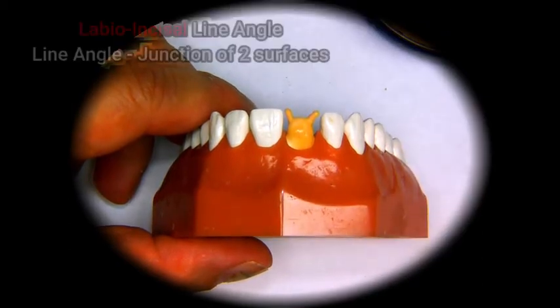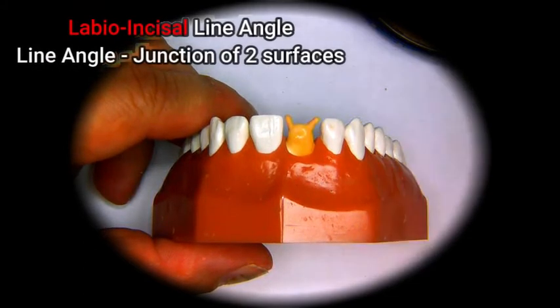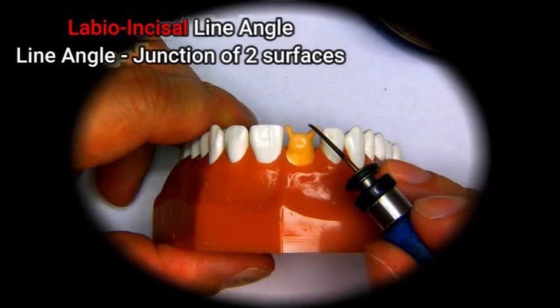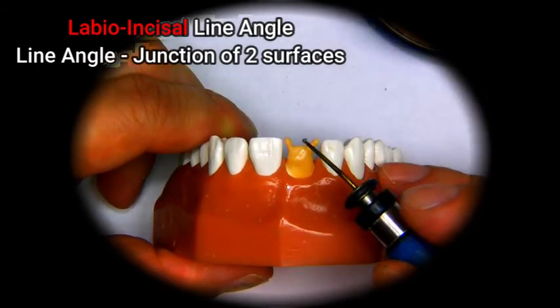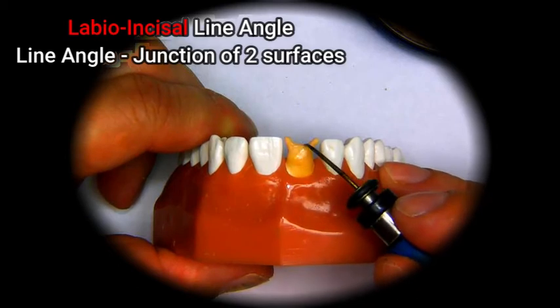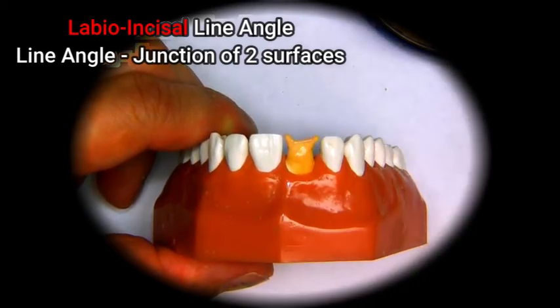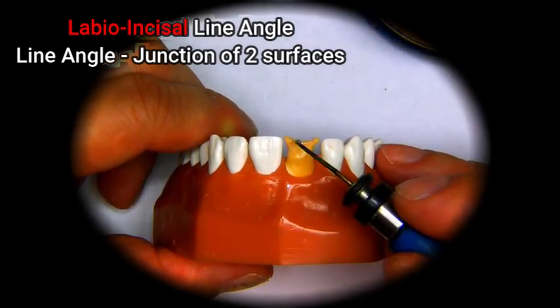So the next portion we wax up is the labio-incisal line angle, which is in essence the incisal edge of the tooth. And to wax that up, all we do is simply fill in the gap between the little horns.